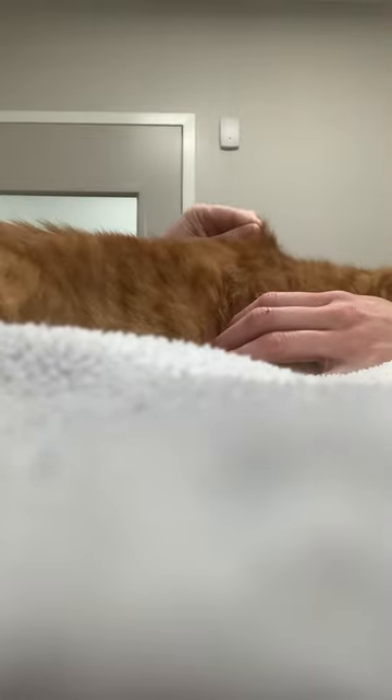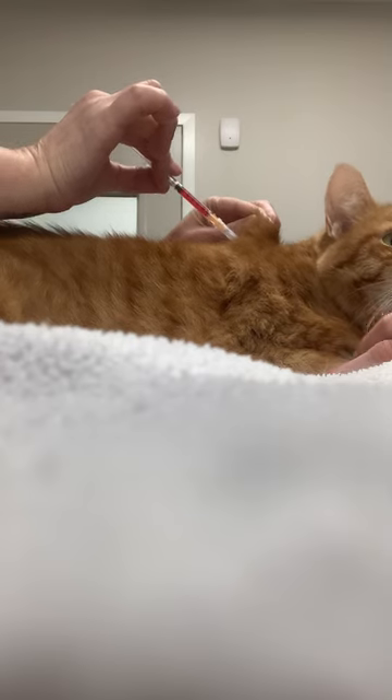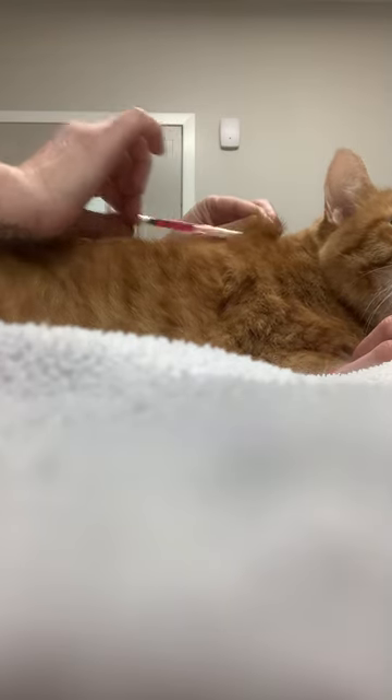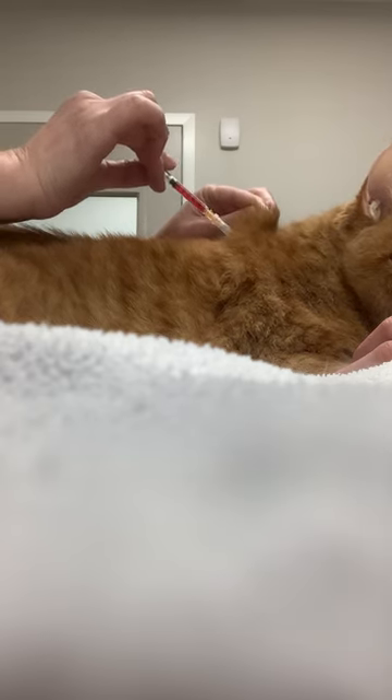Get in between the shoulder blades and with your syringe you'll want to go at a bit of an angle like this. If you go straight on, sometimes you can just go through the skin, so you'll want to go right in the middle of your little tent at an angle just about like this.